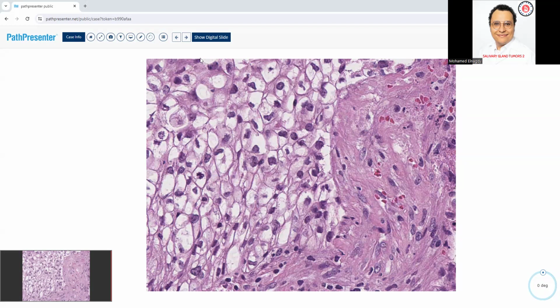Yeah, oh my God, that's a tough case, Abdurrahman, you know? It's too easy that it's tough. If you ask somebody what do you see, they can say, I see some clearing there. Yeah, some clear cells, so that's clear cell. Okay, so that's a very easy case.